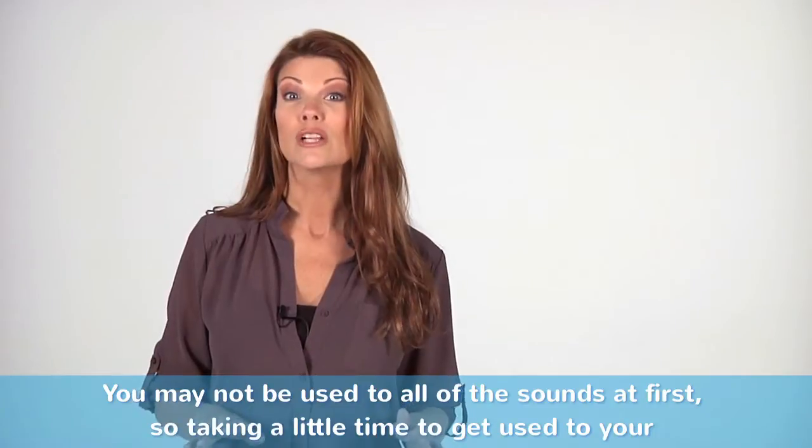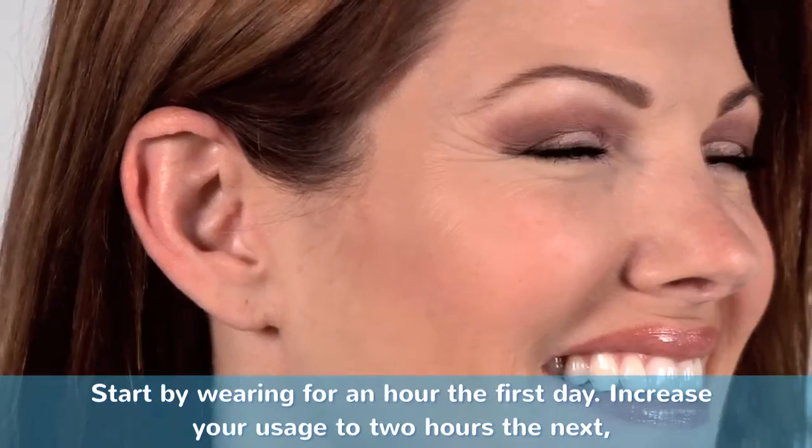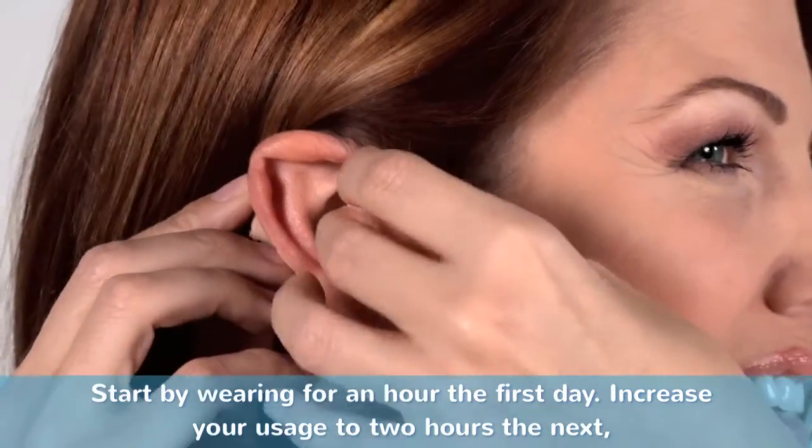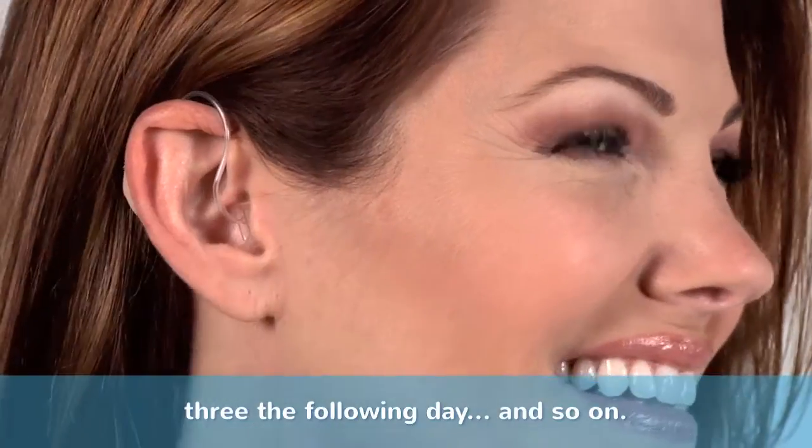You may not be used to all of the sounds at first, so taking a little time to get used to your Songbirds is recommended. Start by wearing for an hour the first day, increase your usage to two hours the next, three the following day and so on.